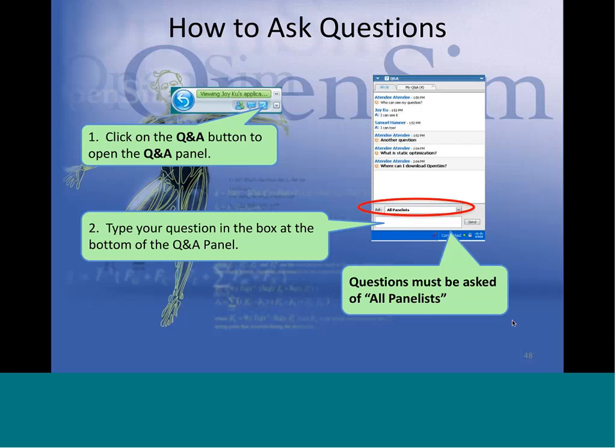Let's see. So first, a question from Dario Cazzola. First, he says, really useful tips. And his question, is there any way to use a combination of marker 3D positions and joint coordinates, i.e. joint angles from either direct kinematics or IMUs, to further improve the model scaling procedure? That's a really great question, and it's definitely one that is useful, especially with the addition of more IMUs for helping with data collection. So the good news is that you can.